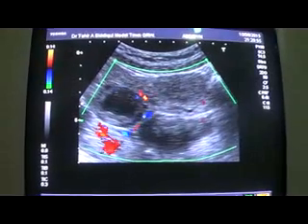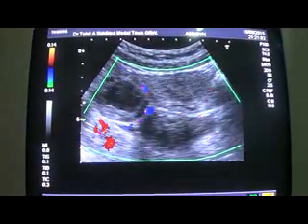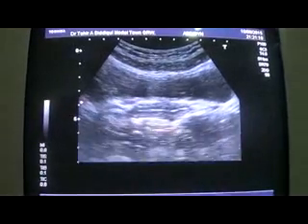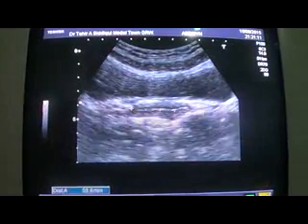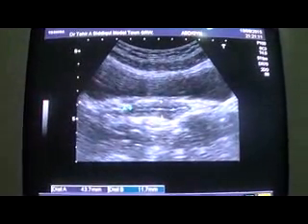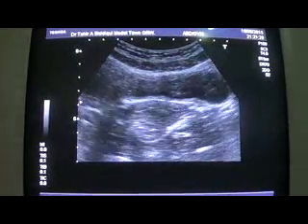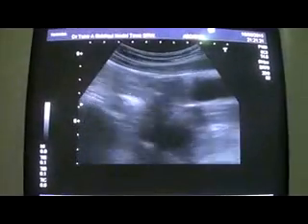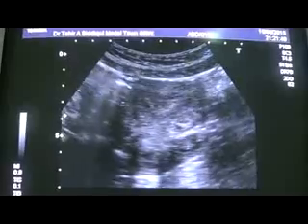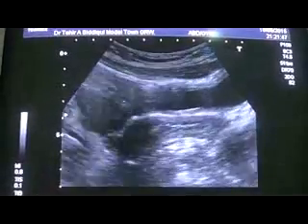Here we are. And the important thing is the cervix: you can see the cervix is elongated. It measures 4.4 centimeters by 4.3 by 1.1 centimeters. This is the cervix. It's unusual to see such a length of the cervix. And if you want to correlate whether there are two cervices or one cervix serving the function of both, and there is one vagina. Yes, there is one vagina.